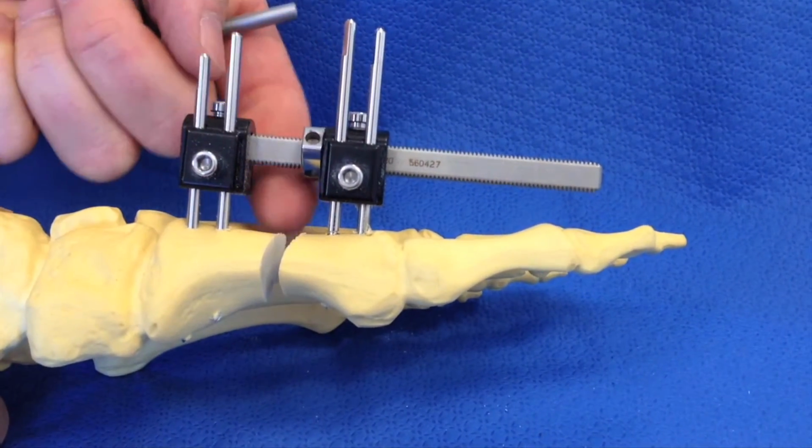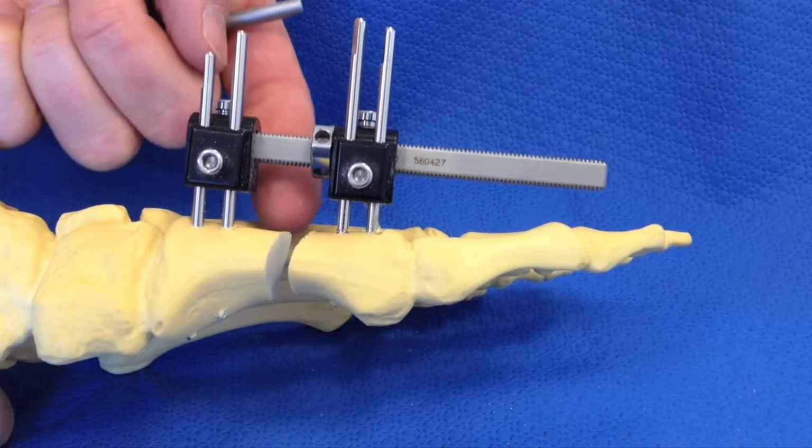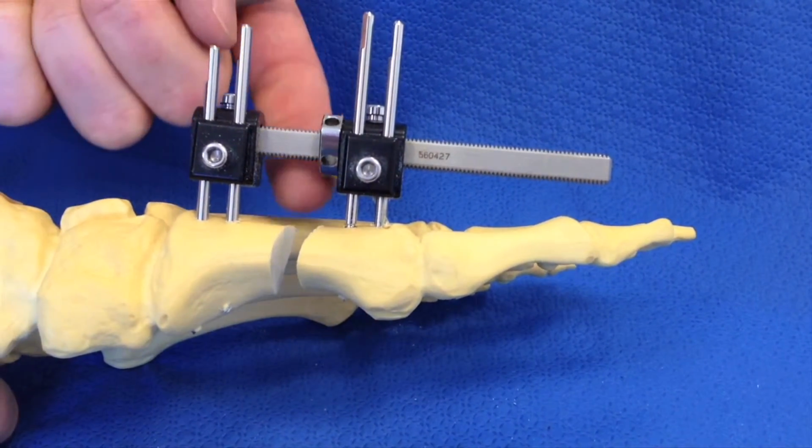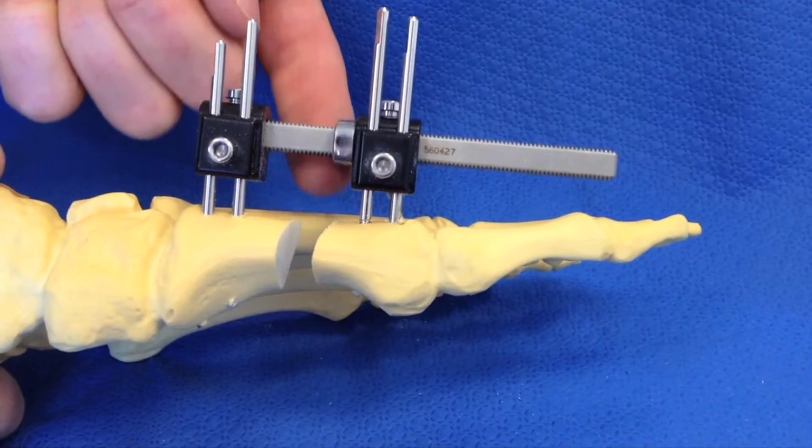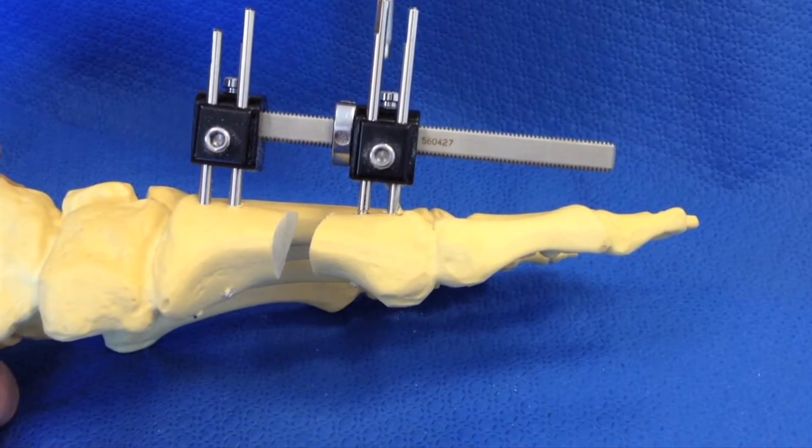And then we can keep doing this at 1/2 millimeter a day until we've grown the desired amount of length, which we will determine by x-ray and clinical appearance in the office.